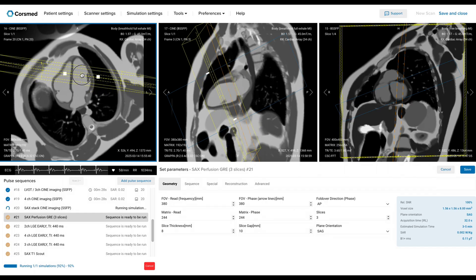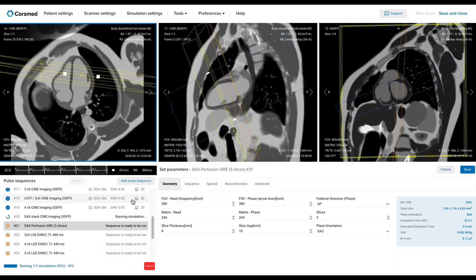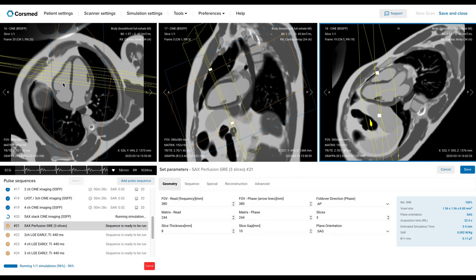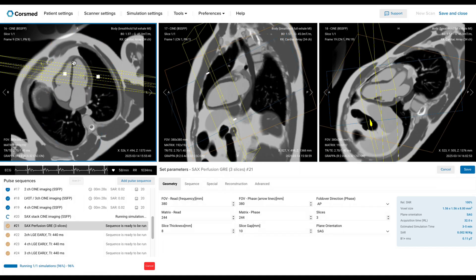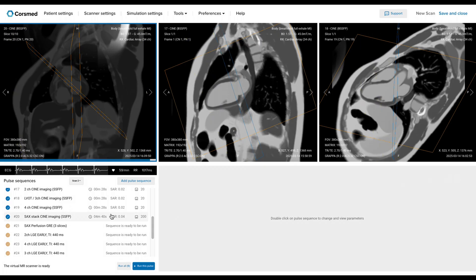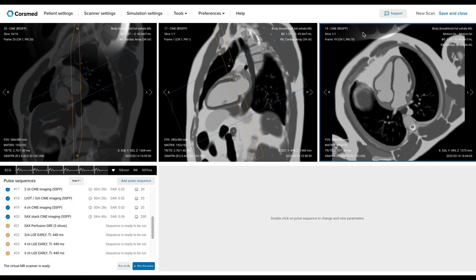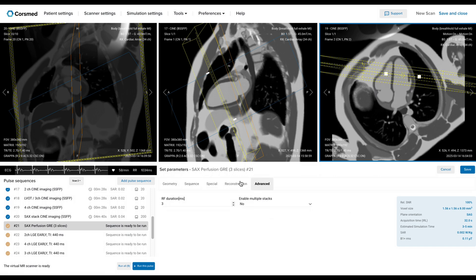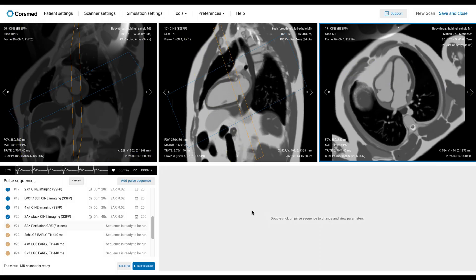Now let's start planning our perfusion sequence. We'll use the long axis view to guide us. Since this is a rest perfusion, we don't need to worry about the systolic phase — the trigger will still be end-diastolic. In the axial view, we want to be perpendicular to the left ventricle wall. We typically use 60 phases for a healthy patient — that's 60 time points capturing the contrast as it flows through. But if the heart's not pumping well, you'll need more phases to catch the full cardiac cycle. The phases are usually in the sequence tab; mine's locked at 32 right now, but that's still enough to cover one heartbeat. I will save and run this pulse.